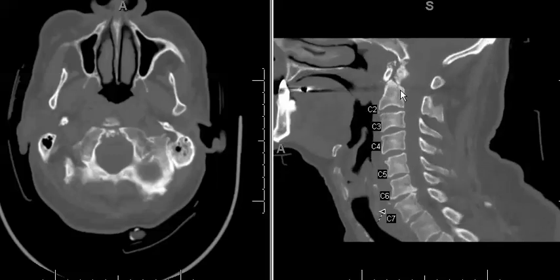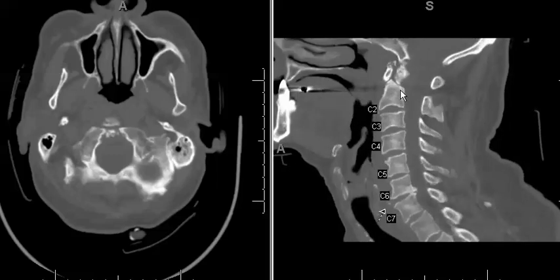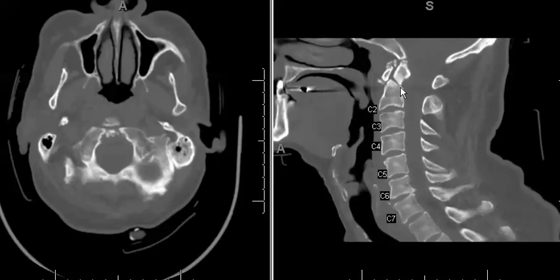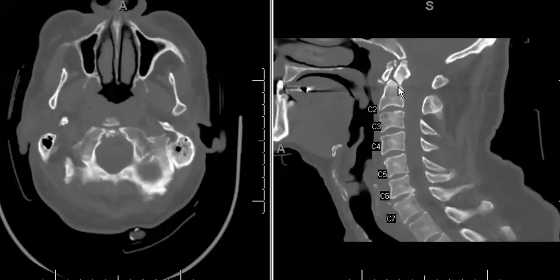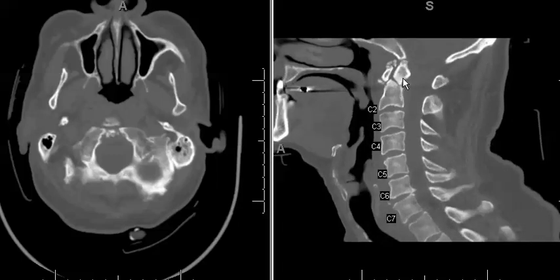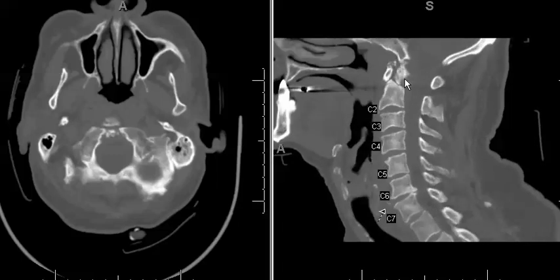The type 2 fracture is the most important fracture, and is the fracture seen in this case, because of its high risk for non-union and typically may require surgical treatment. In this case there was also retroversion and posterior displacement of the odontoid fracture fragment.